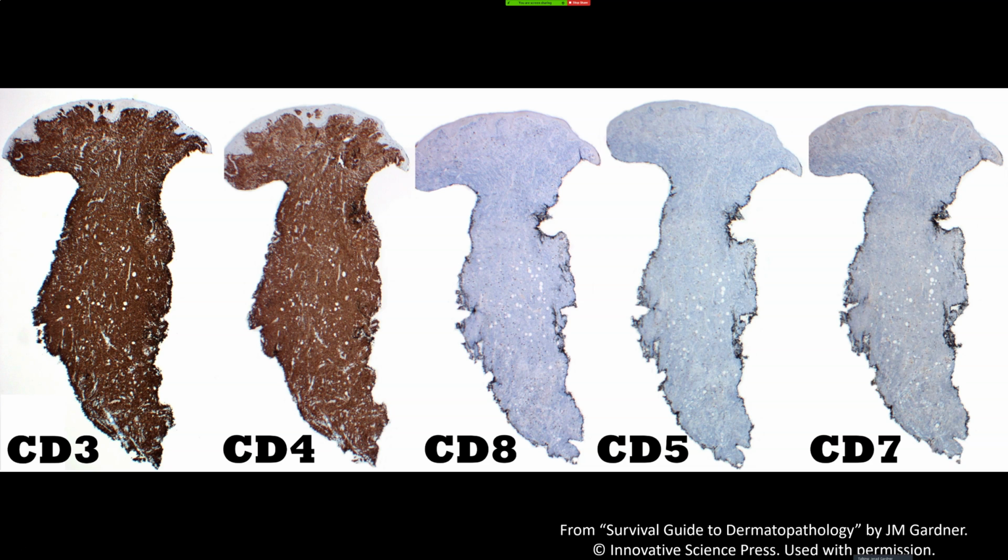So I think some things that I've picked up over the years is, in the early subtle cases, it's very common for early subtle MF to get misdiagnosed, not even once, but several times on biopsy as a non-specific infiltrate or mild spongiotic dermatitis or chronic spongiotic dermatitis. And that's a really normal thing, and that's usually nothing to do with the skill of the person looking at the biopsy. It's just the fact that it's really difficult in early cases.